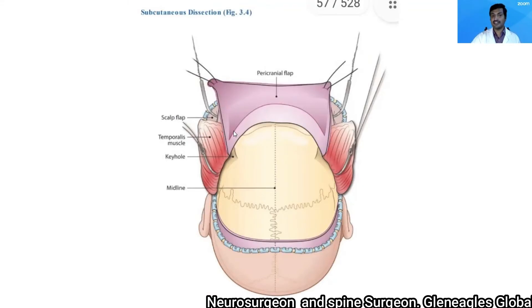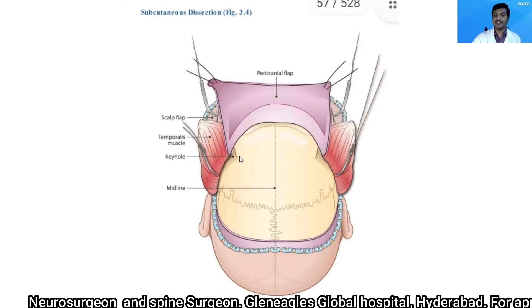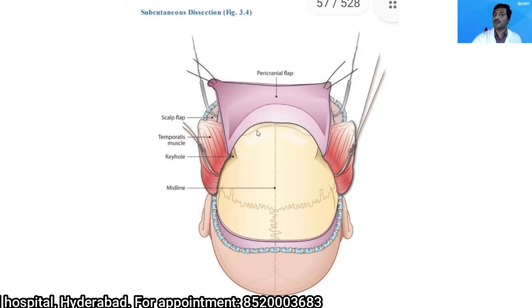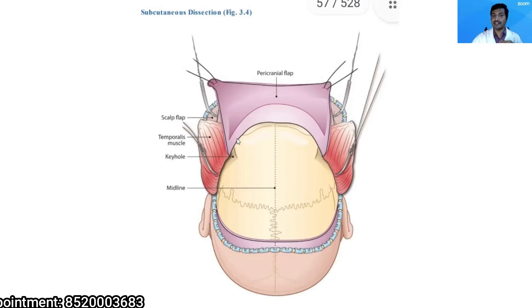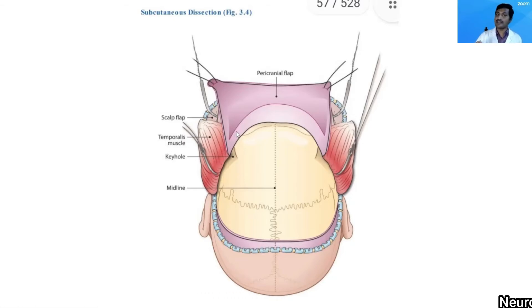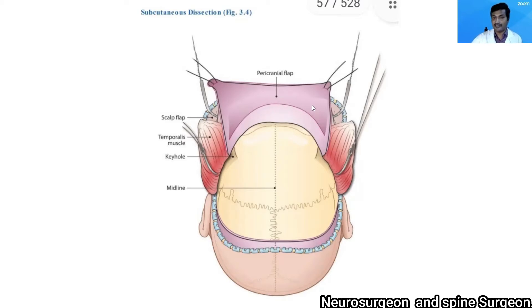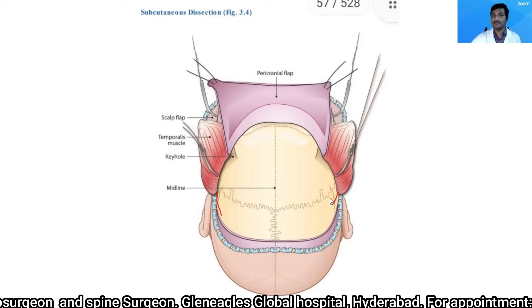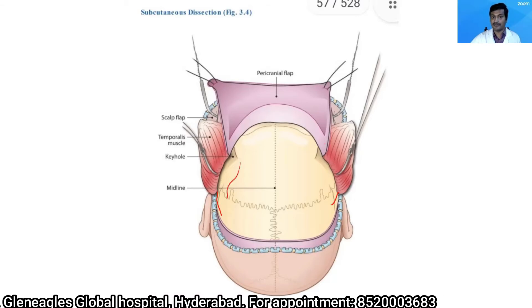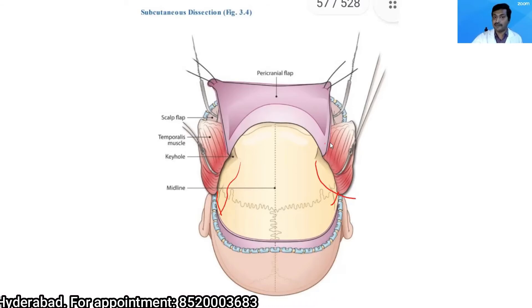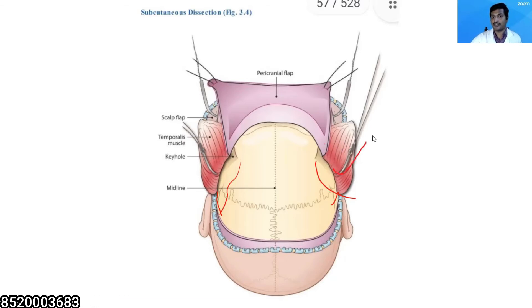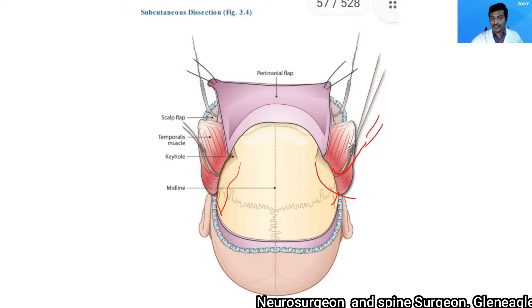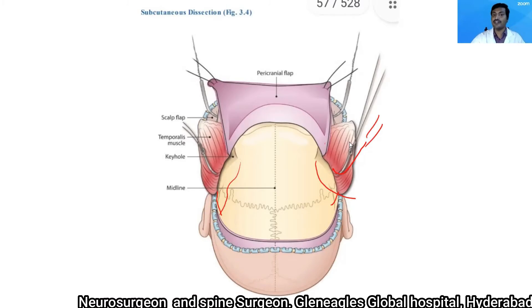Using a combination of periosteal elevator and blunt dissectors, I elevate the pericranial flap. Every effort is made to keep the pericranial flap intact without holes; if there is a small hole, I suture it back. The temporalis muscle is cut at the posterior extent of the incision, detached from the superior temporal line on either side, and reflected anteriorly. When reflecting any flap, I use gauze rolls to avoid kinking the blood supply.